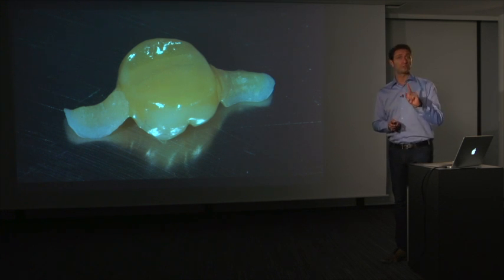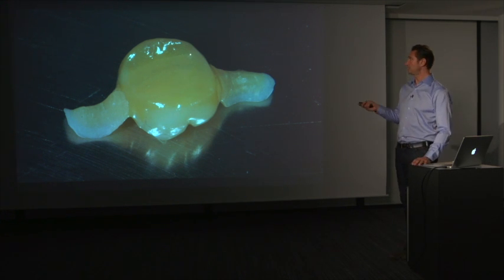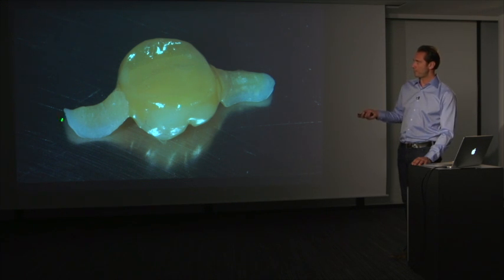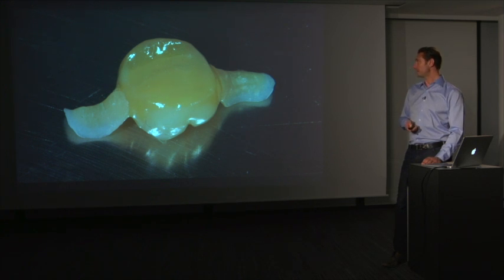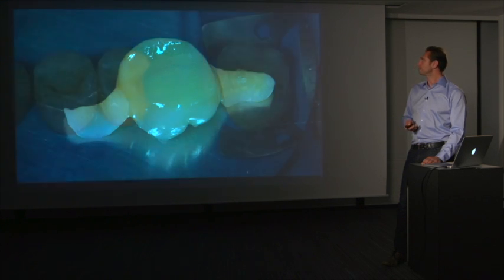As preparation, of course, which is very important, the pontic should be kept as smooth as possible, as you can see, and the wings, of course, should be prepared according to the rules, meaning aluminum oxide sandblasting, and priming with composite primer.